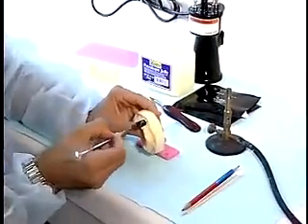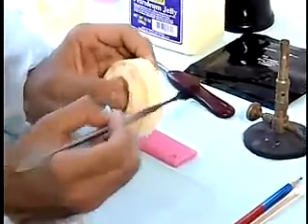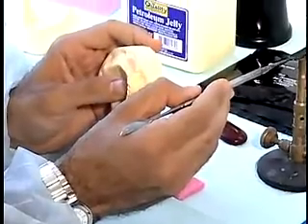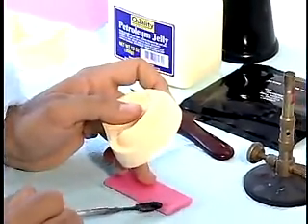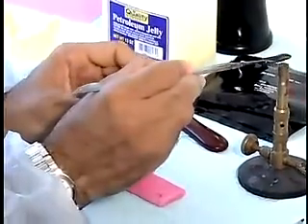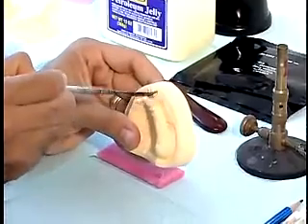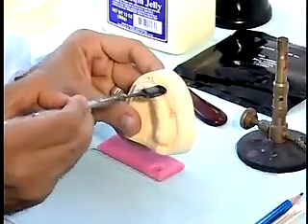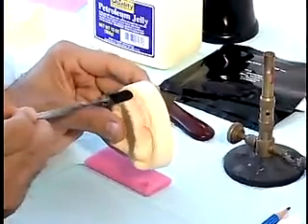Block out excessive undercuts in the preliminary cast with base plate wax. Do not over wax the cast or the tray will not fit the mouth accurately. Be especially conservative with your wax blockout in the maxillary labial flange area. Too much wax blockout can cause just as many problems as too little blockout.